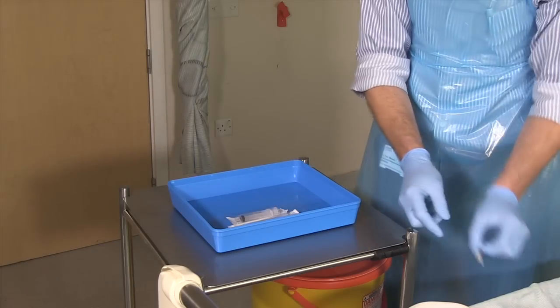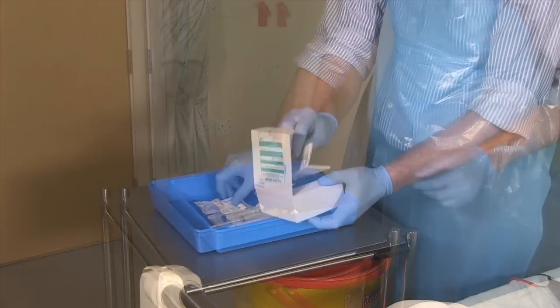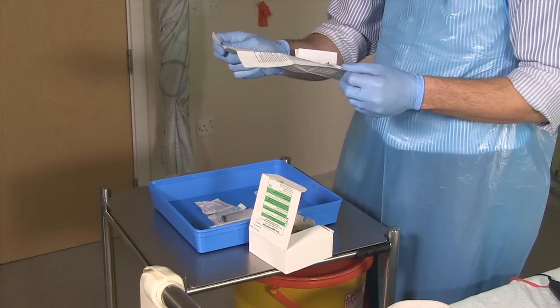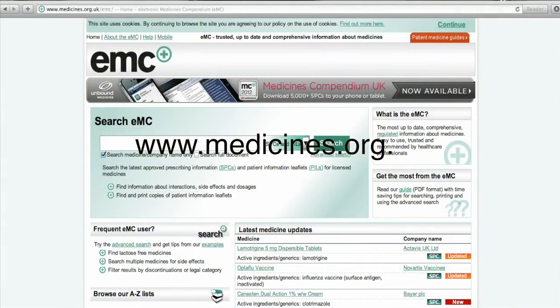Make sure you've got all the syringes you're going to need and a drawing up needle. In the box that the antibiotic comes in will be a piece of paper that tells you what to dissolve it in — it's usually saline or water. If the paper's not there then you have to look it up on the website www.medicines.org.uk where you'll find instructions.